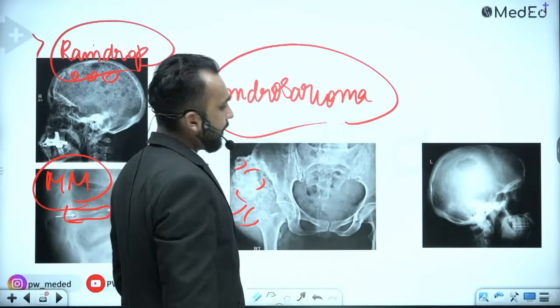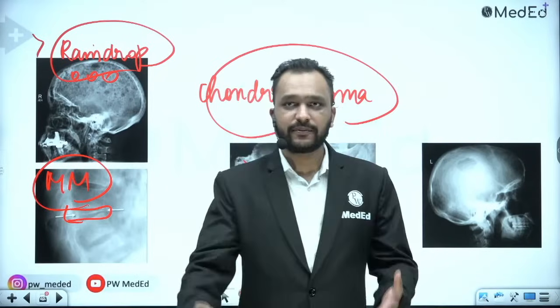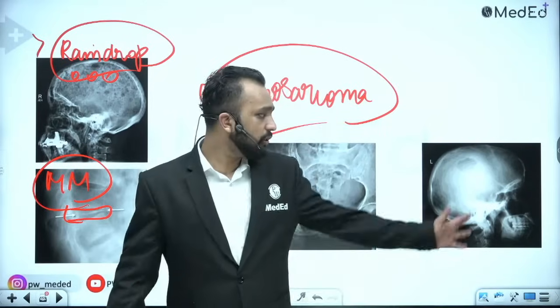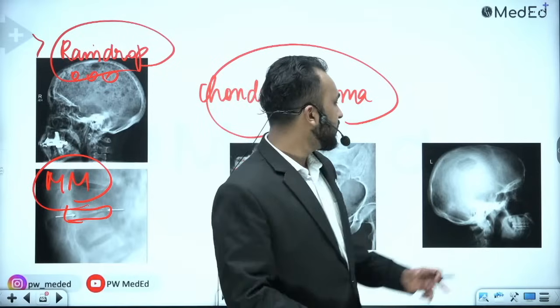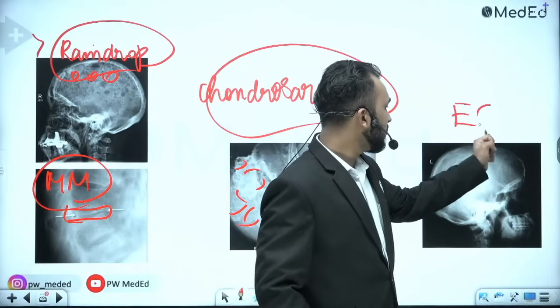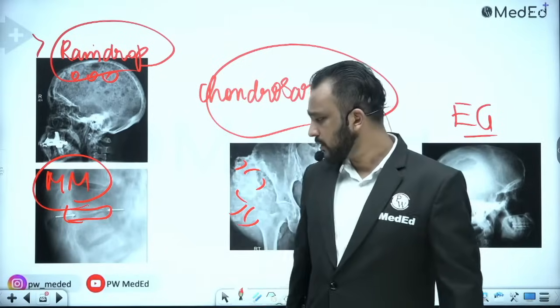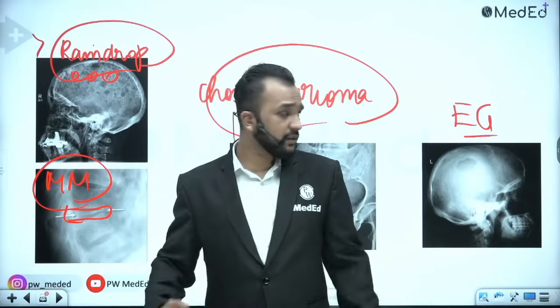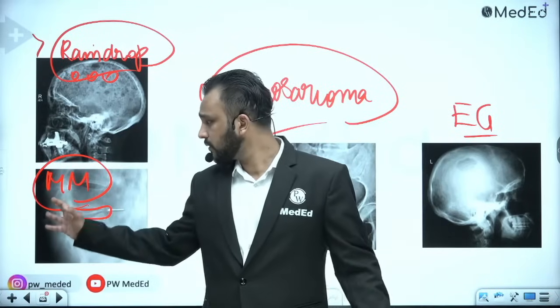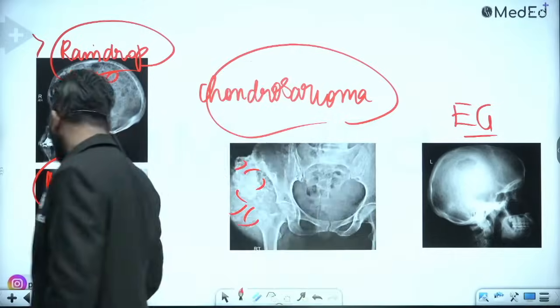Okay. Isolated lytic lesion of the skull that gives a hole within a hole appearance. Hole within a hole appearance is seen in eosinophilic granuloma. Eosinophilic granuloma. And you can also have a vertebra plana in these patients. That was your thinned out vertebra giving a silver coin appearance.